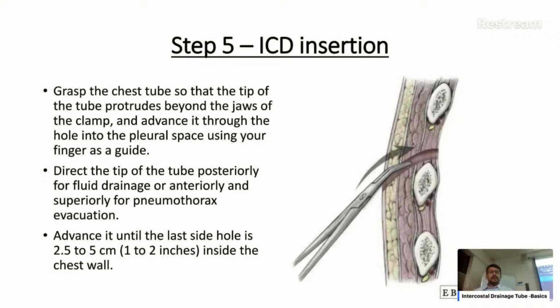We have to keep in mind that we have to advance the tube until the last hole is 2.5 to 5 centimeters inside the chest wall.